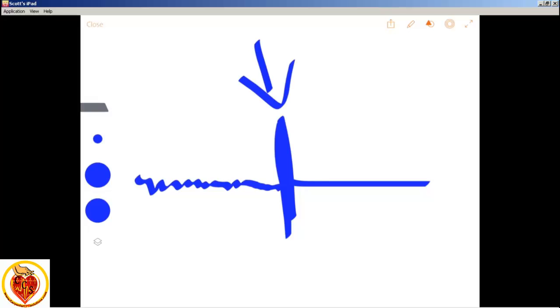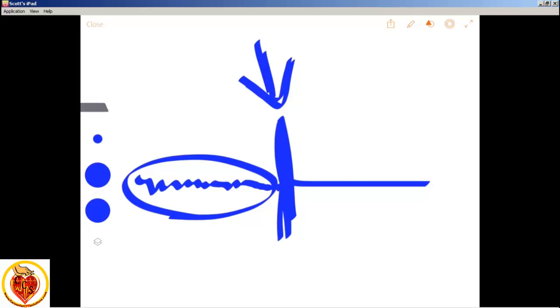Automated external defibrillator asks itself a couple questions. Asks it out loud, actually. Analyzing rhythm, stand clear. It's asking itself, is the patient in ventricular fibrillation? If that TV set is on static, it will deliver this power surge to the TV set, which will shut it off for 3, maybe up to 5 seconds. An absolute refractory period where there is no electrical activity. And that's, again, all the AED does.